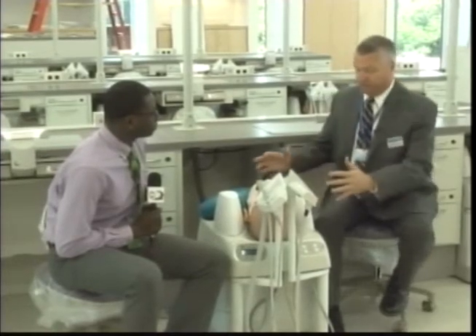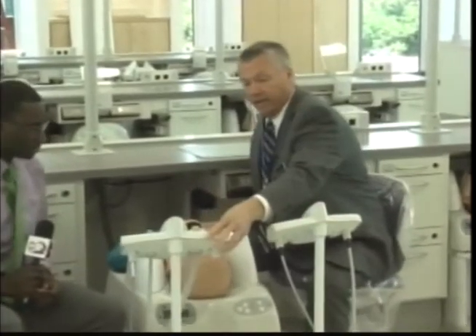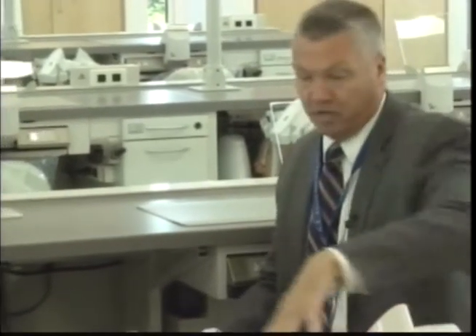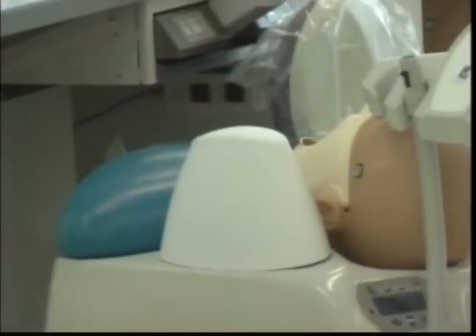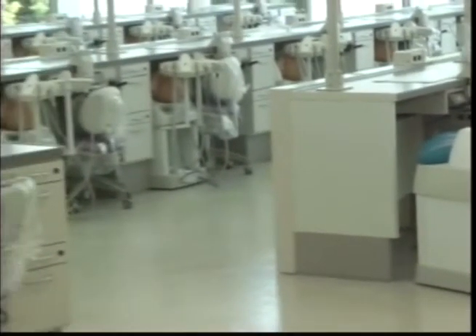The room is set up such, as you can see in front of me here, there's a mannequin. This is an area where the dental students can learn to properly place a patient, also properly place their instrumentation. This is where the dental drills would go, and the air water syringe for treating a patient. So at the station, students will be able to work in a very realistic simulated setting. There'll be instructors around the floor, walking around watching the students. We also have the main instructor station at the front of the room.